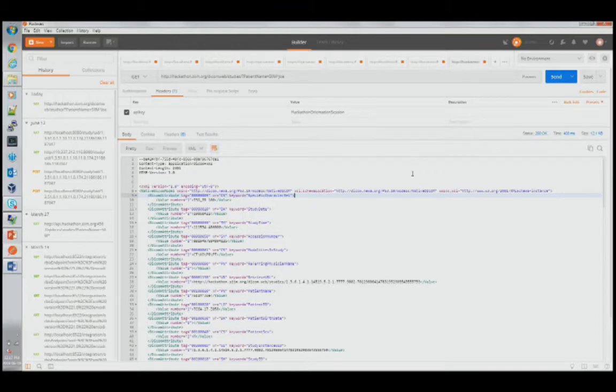One stark difference you'll notice right off the bat with DICOM web versus FHIR is that DICOM web will tend to return objects in HTTP multipart. Okay? You'll notice there is the first part here. I don't know if anybody here is familiar with multipart, but it's the same technology that's used for emails. So when I send an email, the actual text of my email is one part, and then the attachments that I'm sending are each individual parts. It's the same thing with DICOM web. The reason is that in DICOM web, sometimes you can request multiple objects at once, and they're returned in one response. But it wants it to be very clear which chunk is which, without any kind of interference between them. Okay? So here's an example.